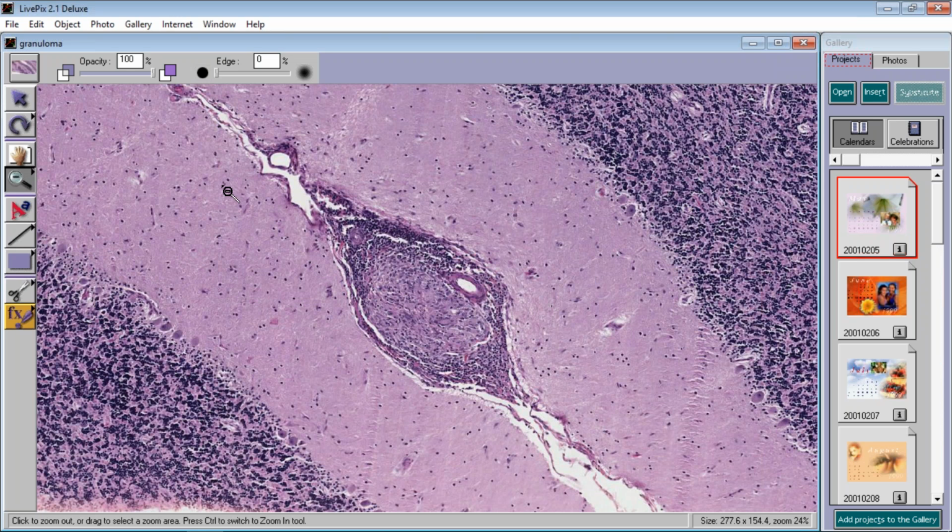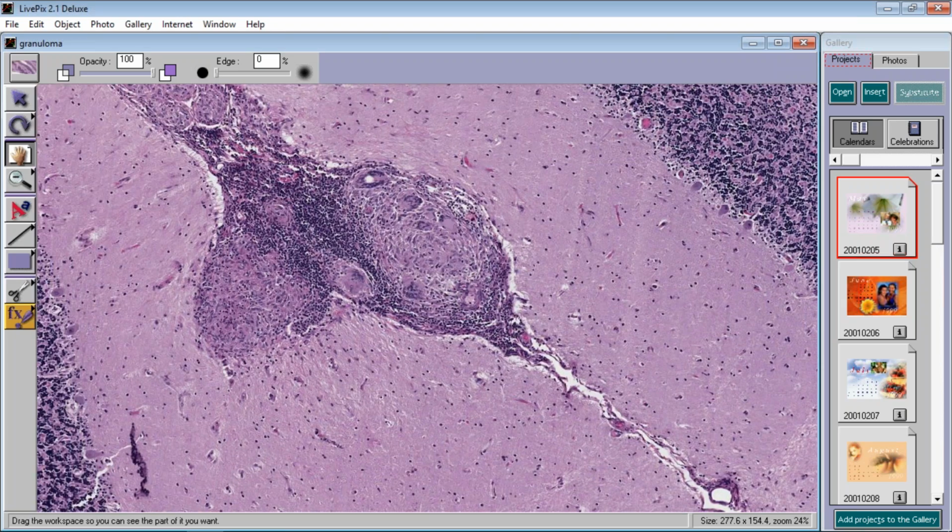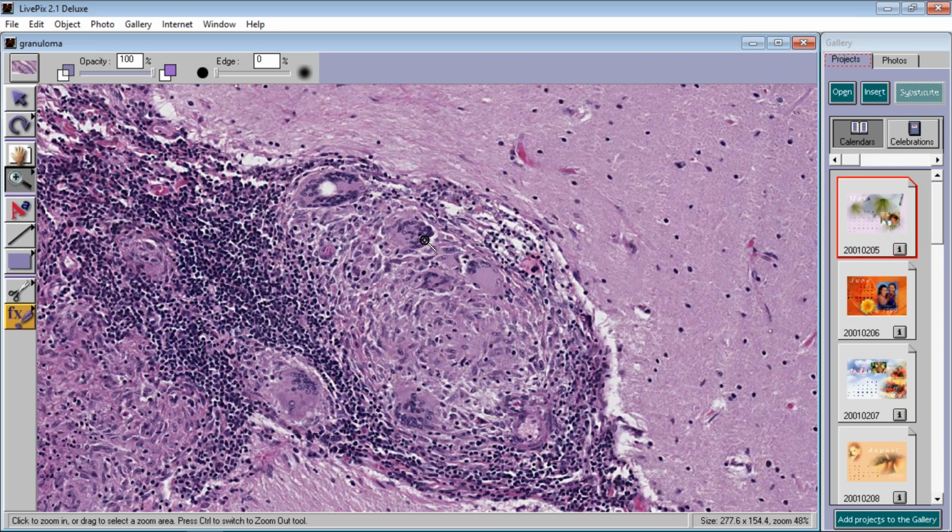So these are non-caseating sarcoid granulomas. Look, there's another big giant cell. There's a big giant cell. There's a big giant cell. It should almost be a knee-jerk reflex. Whenever you see a collection of cells and there's all of these multinucleated giant cells with them, you can probably almost instantly call these things granulomas.